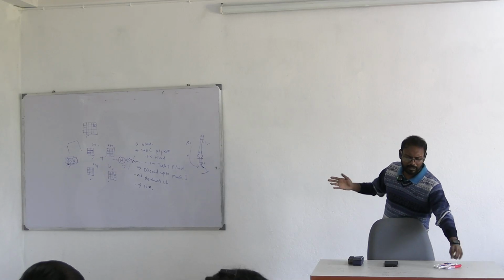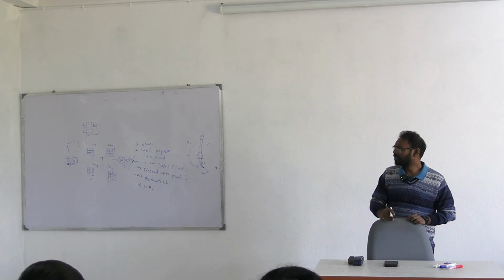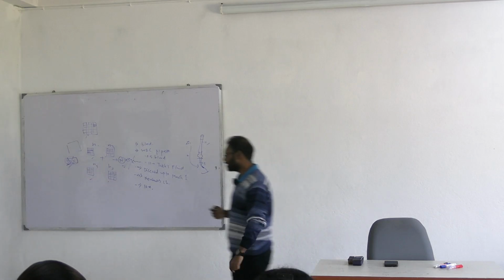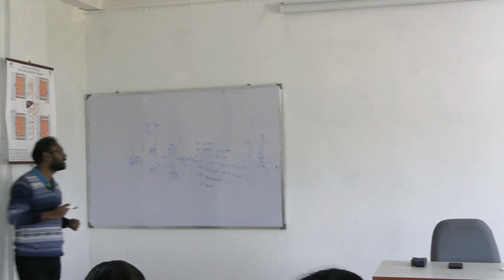So previously we have done the differential count. Differential count means the percentage of every WBC component present in our blood. And today we will be calculating the total value of them. Okay, so the differential count is done. Now we will be calculating the WBC count, the total count of WBC, not the differential one.